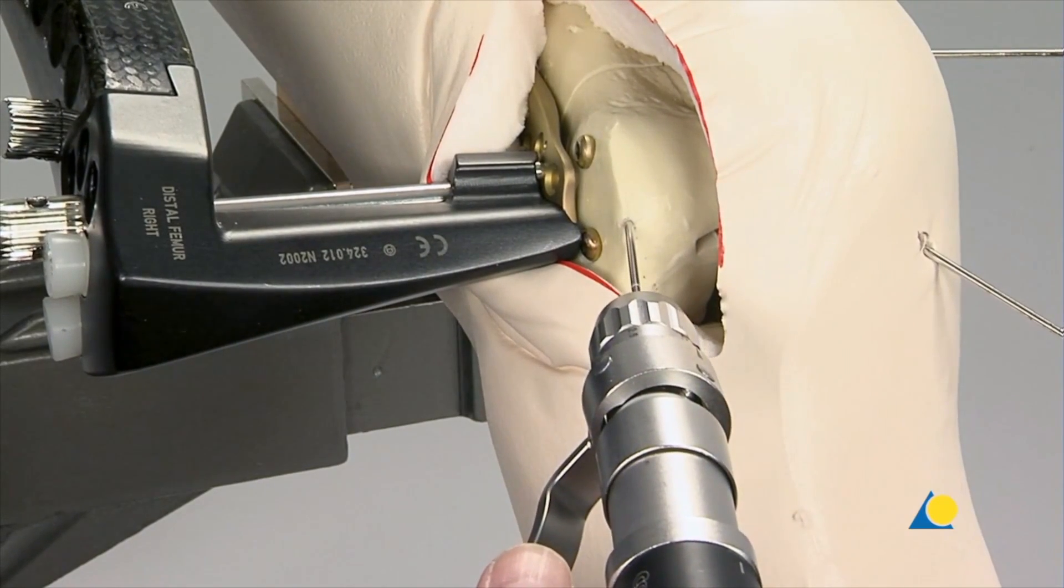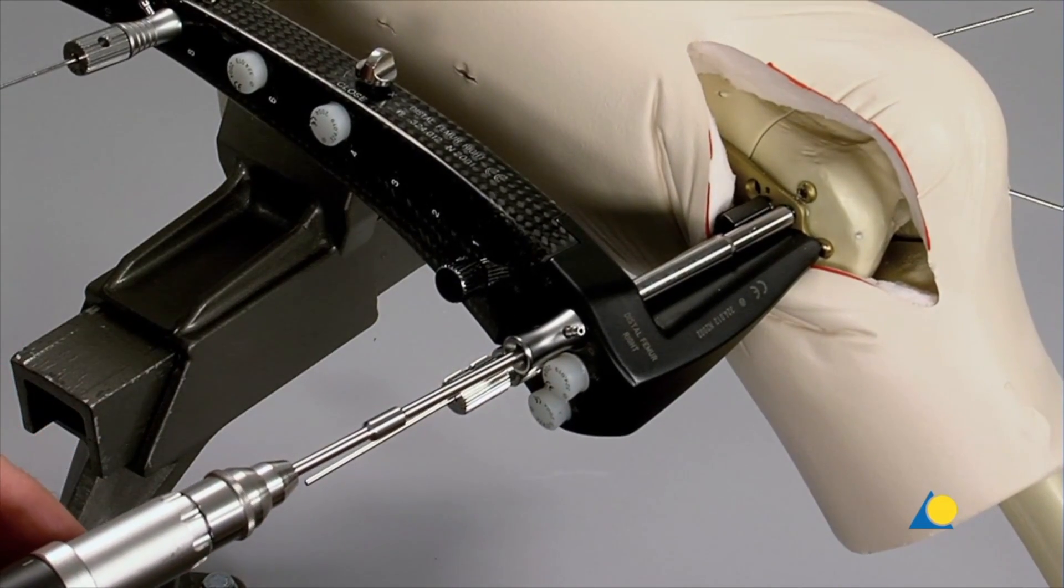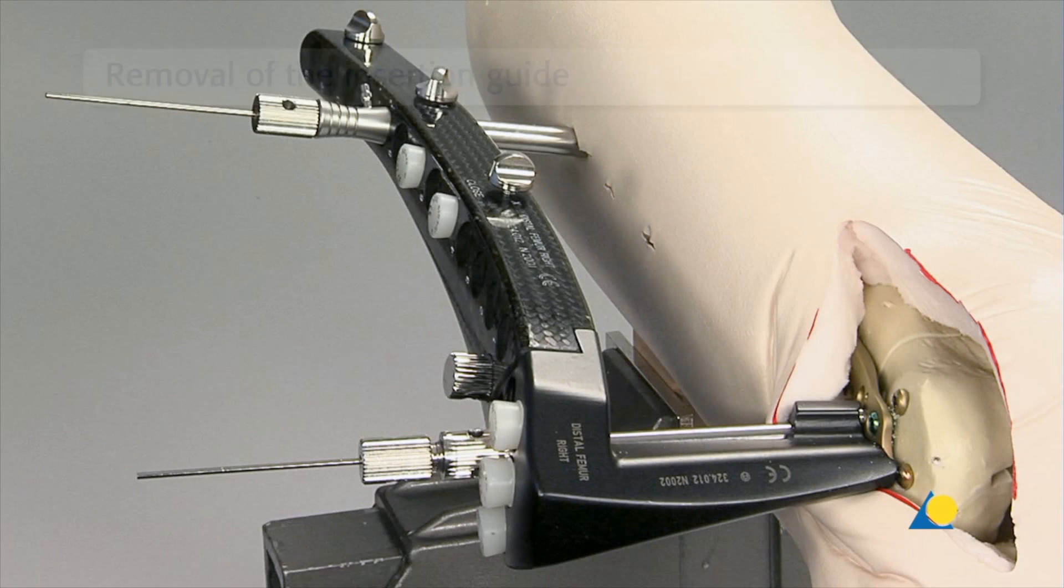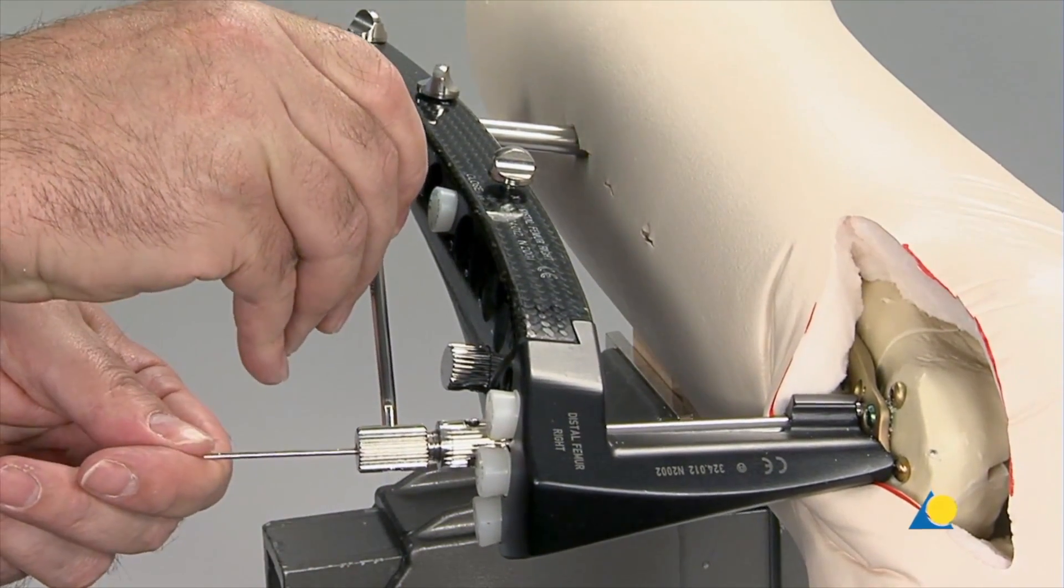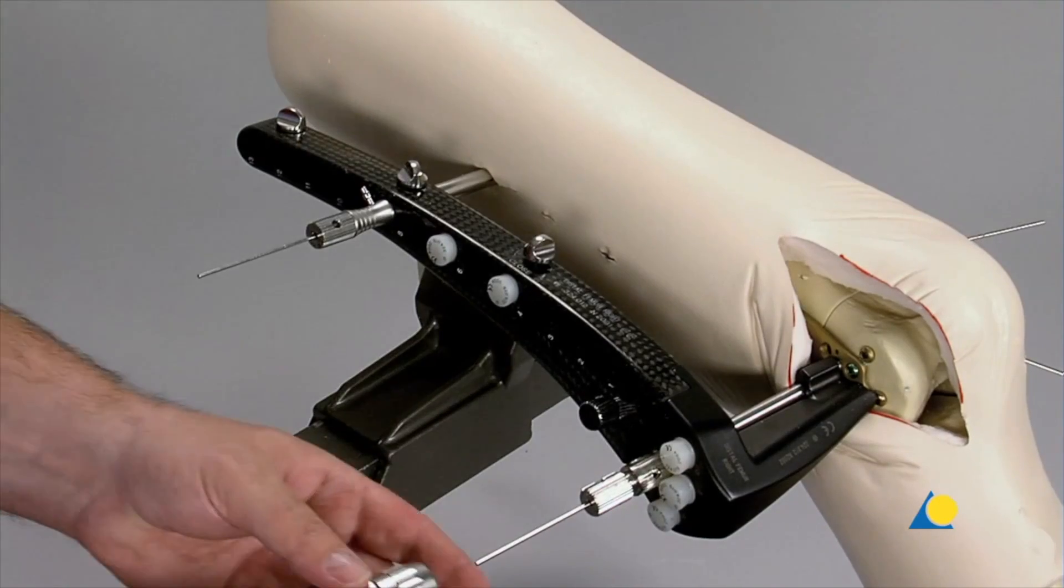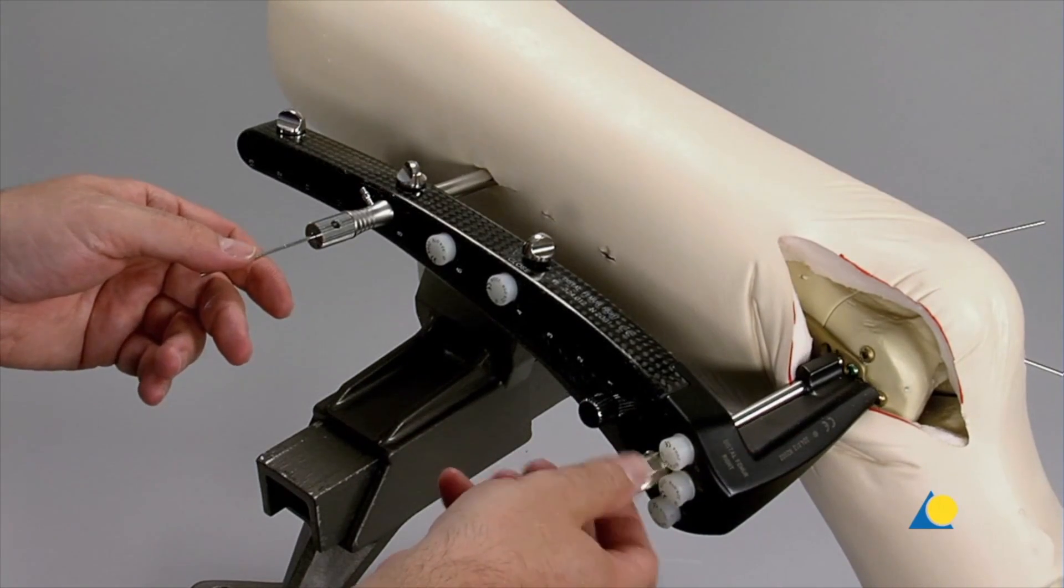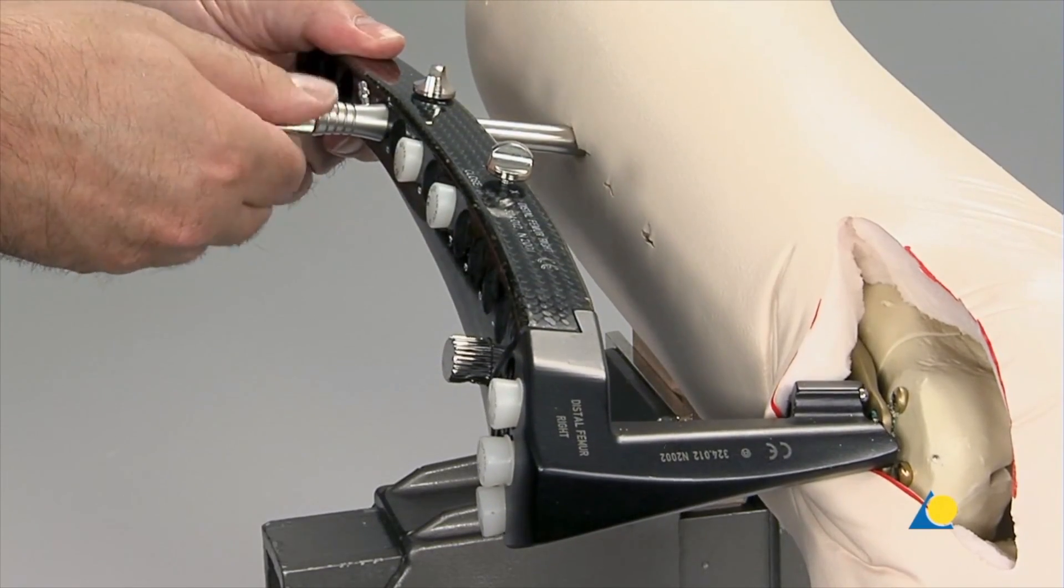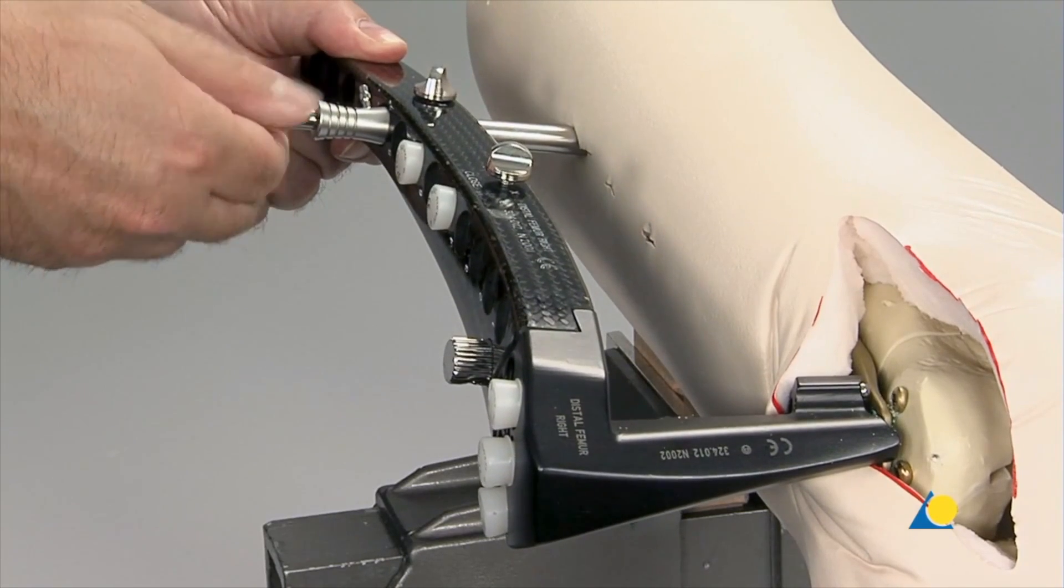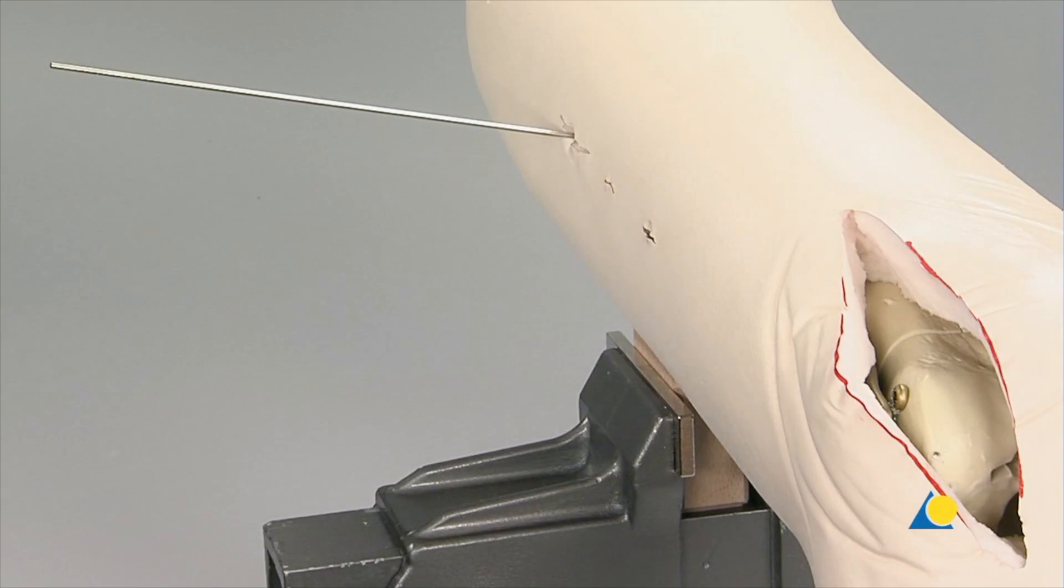Before introducing the next distal screw, the provisional K wire that secured the reduction is removed to avoid any interference during screw insertion. There may be some instability when the proximal end of the insertion guide is used for screw insertion. In this exercise, the last proximal screw will be inserted freehand, so the insertion guide is removed. The distal stabilization bolt is loosened. The K wire and the stabilization bolt are removed. The proximal stabilization bolt is also removed. The insertion guide is now removed, leaving the K wire in place as a guide for the stabilization bolt. The stabilization bolt is slid over the K wire and locked into the plate.